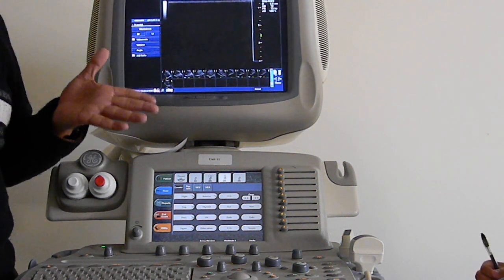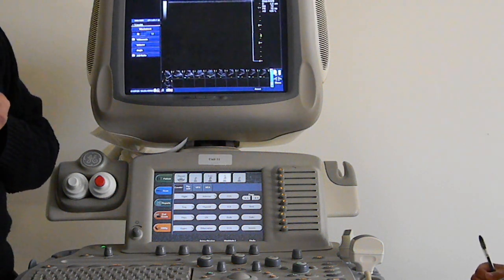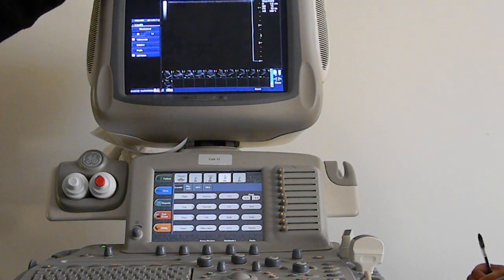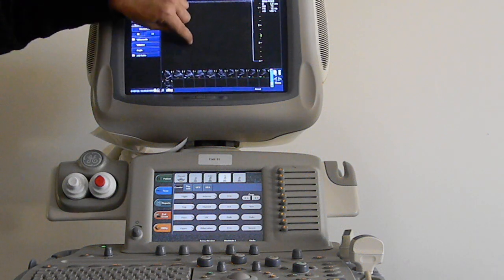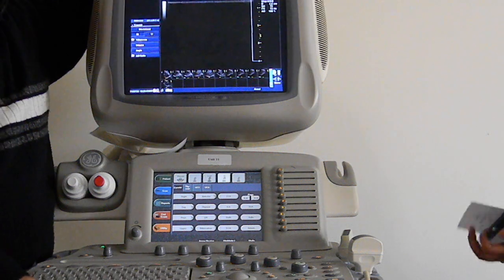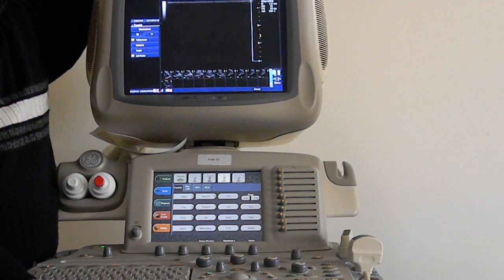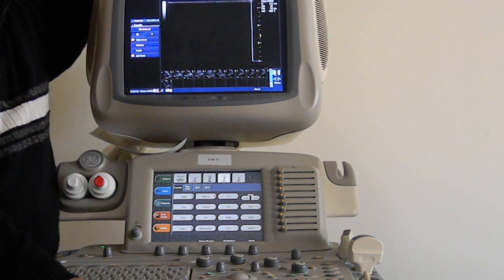I like depth gain compensation more because some of you may ask what is the matter of the time? Well, time is meant because the sound wave travels and comes back, travels and comes back. So that's why they also call it time gain compensation. Gain is anything that has been increased.